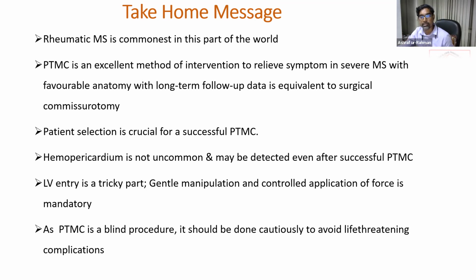LV entry is a tricky part. Gentle manipulation and controlled application of force is mandatory. As PTMC is a blind procedure, it should be done cautiously to avoid life-threatening complications.